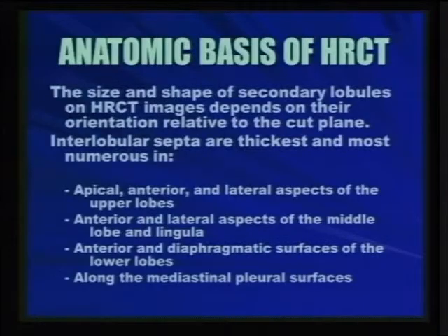And as we're going to evolve talking about the different patterns in the lung CT especially, you're going to see that most of what happens at the level of pathology, most of what happens in the lung, will happen at the level of the secondary pulmonary lobule. And everything will be a reflection of what happened at the level of the secondary pulmonary lobule. So we're going to spend a few minutes just talking about the secondary pulmonary lobule.